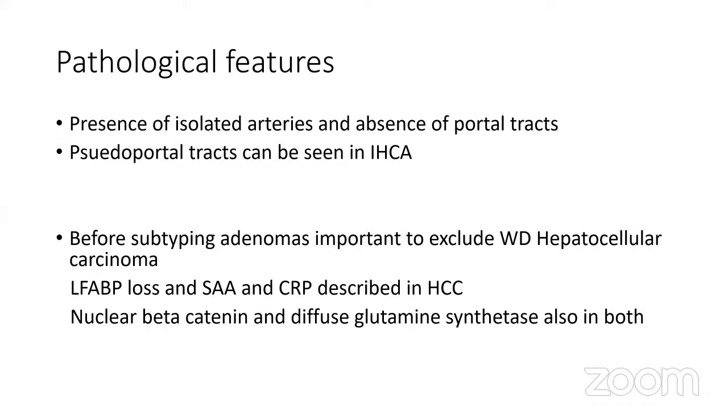A pathologic feature of adenoma is that we know we are in a lesion because there is absence of portal tracts and there is presence of isolated arteries. Pseudoportal tracts, by that we mean bile ductular proliferation, can be seen in inflammatory adenomas.